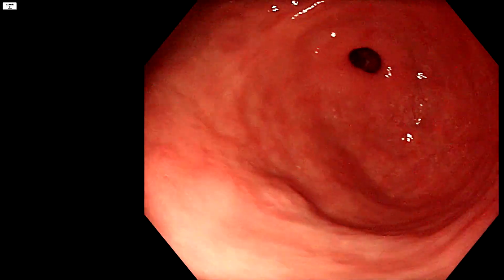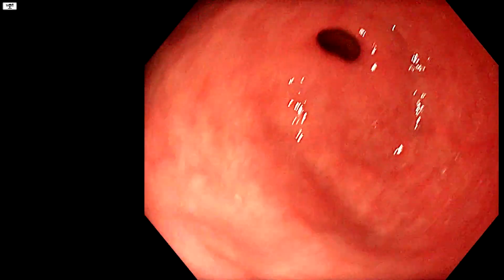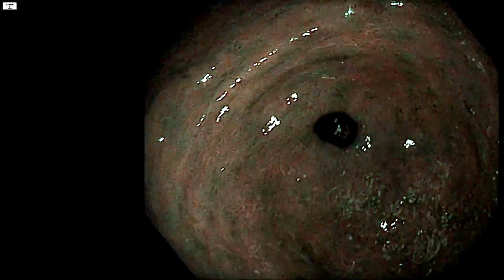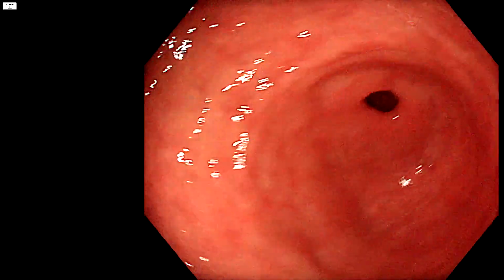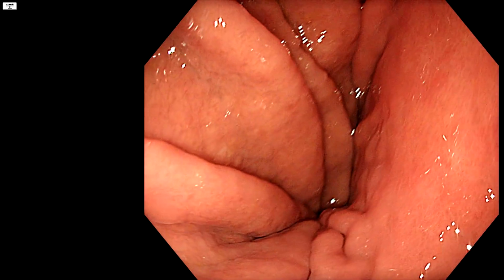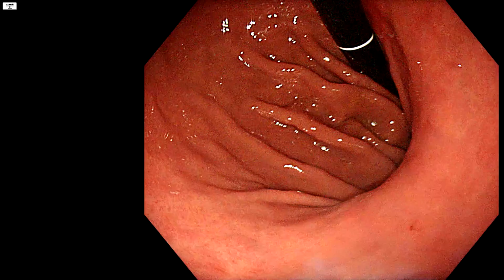So we see here that there is mainly atrophy. It's not so easy to see islands of intestinal metaplasia here. I don't really see too many of them. Therefore, we're talking about global atrophy of the antrum. And this is the classic thing people do. This is their gastroscopy. They pull up, maybe they do this, their photo of a J maneuver. And how much of the stomach have we missed here, right?